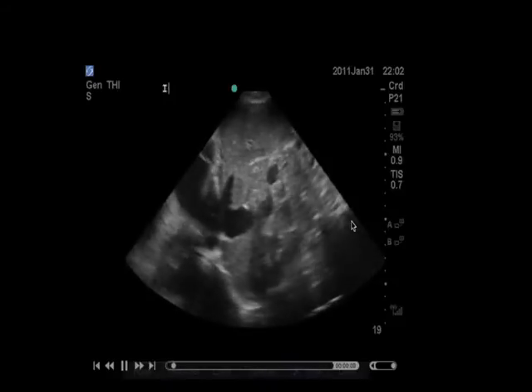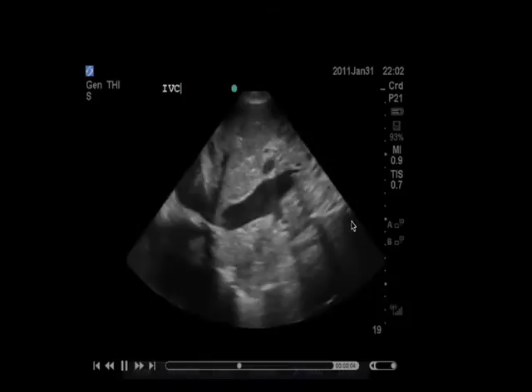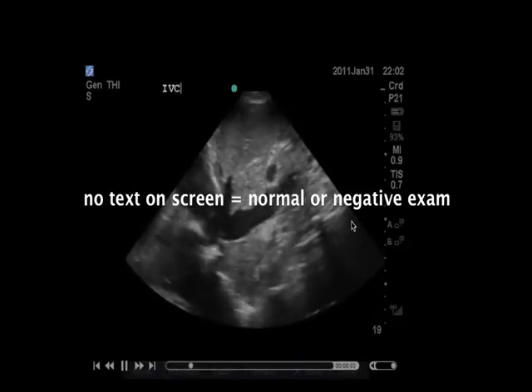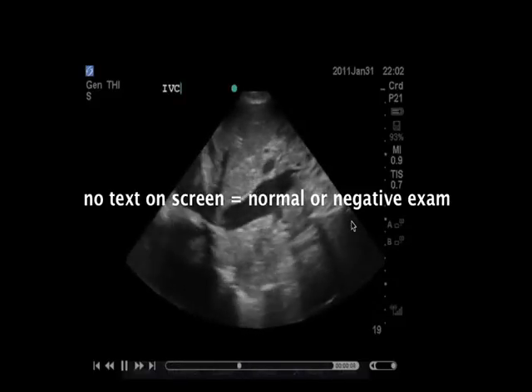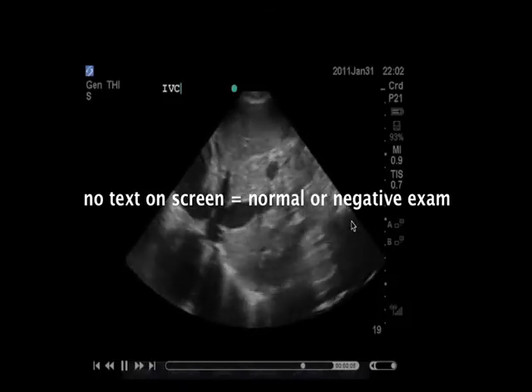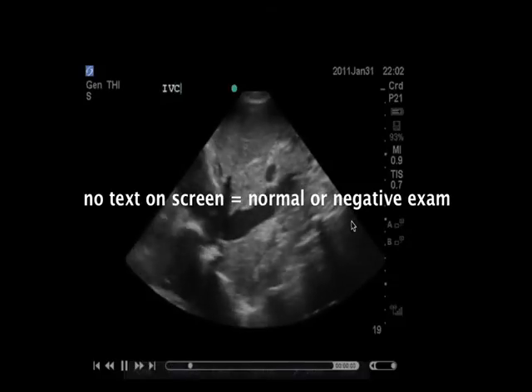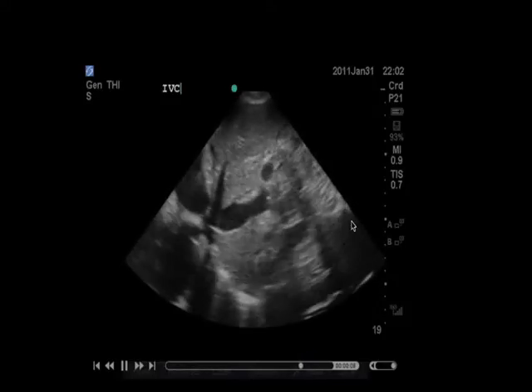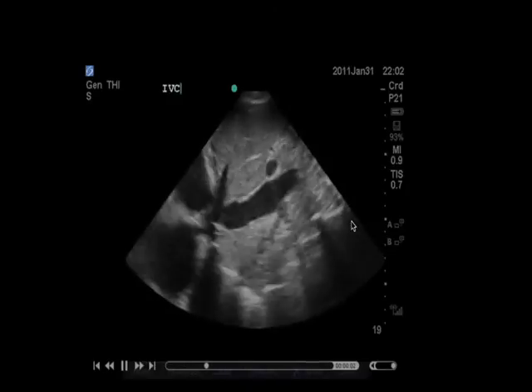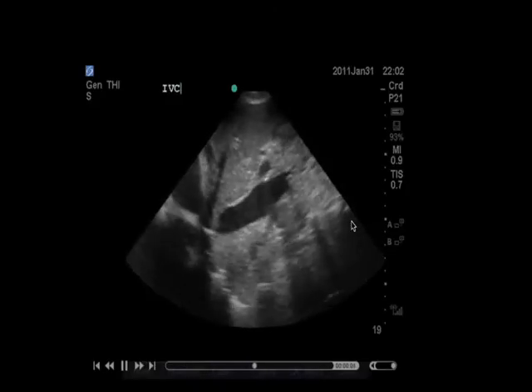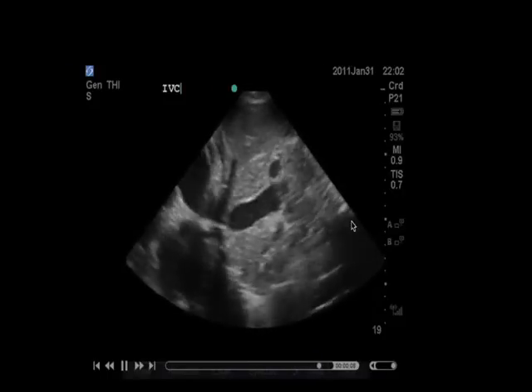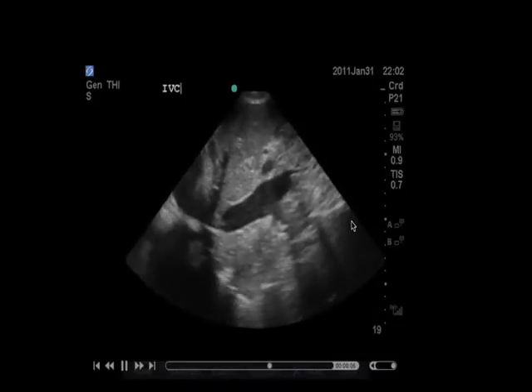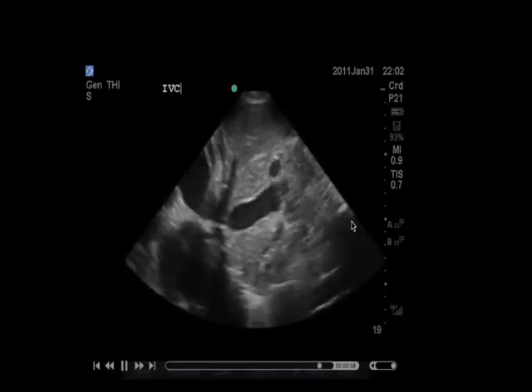Now it's important to note that because the bulk of our scans are actually normal findings and negative exams, the default presumption is that if you did not type anything on the screen, it's a negative exam. So if you have a normal FAST exam, for instance, you save your images of the right upper quadrant, left upper quadrant, and pelvis, and simply no annotation is required. If we saw a slip of free fluid in your saved images and there is no text on the screen, that would trigger a discrepancy, and you would know about this by getting an email follow-up asking whether you saw the free fluid. So if your exam is normal or negative, you needn't type anything. If it's positive or there are other descriptors and qualifiers you wish to communicate, please annotate them on the screen by typing them in.